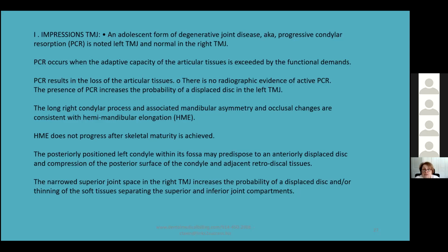So could you really only treat this patient for surgical extractions? Looking at all of this, how does a GP or even an oral surgeon make this decision on how to treat and what to treat with no other collaborative input? Anybody?